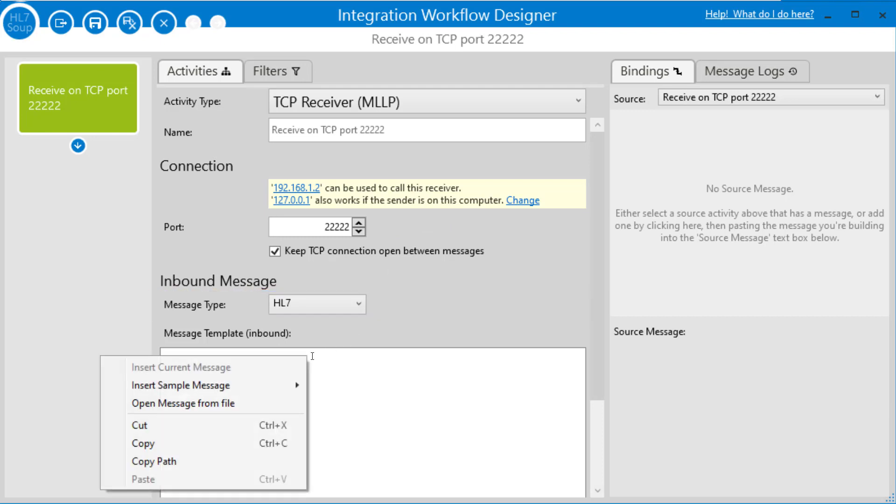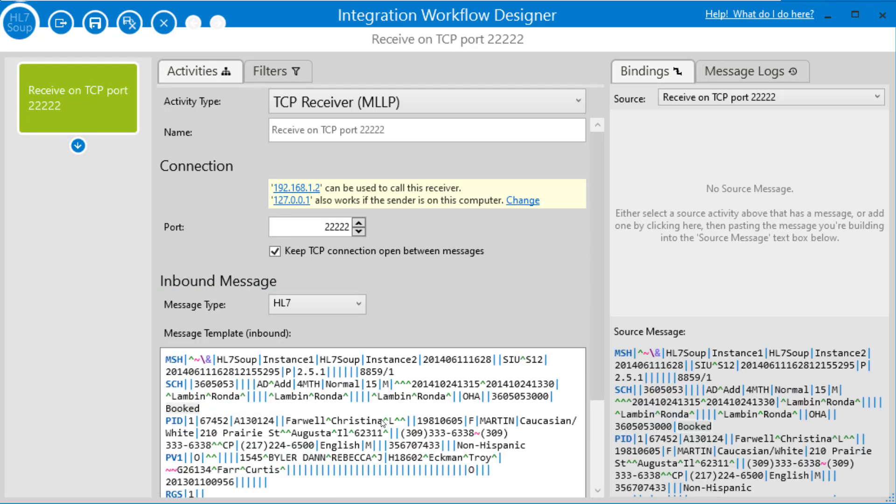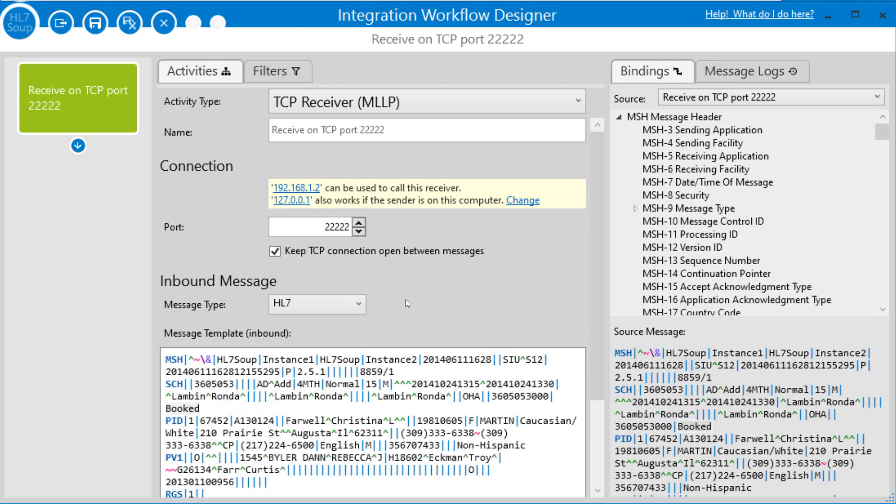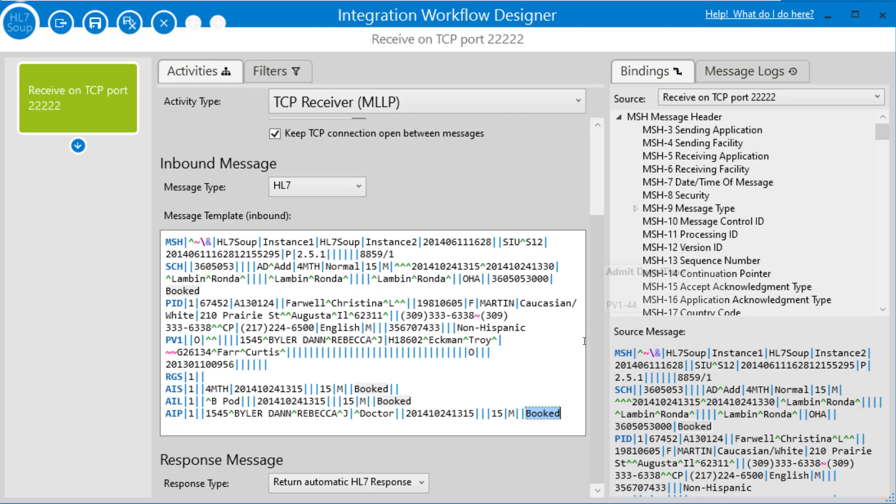I'm just going to right click on the message and insert the sample message, and I'm going to insert the sample SIU S12. This is so we've got a message to base our bindings on, but you'd use your own one if you have one. But otherwise, the sample message is an excellent resource for this.